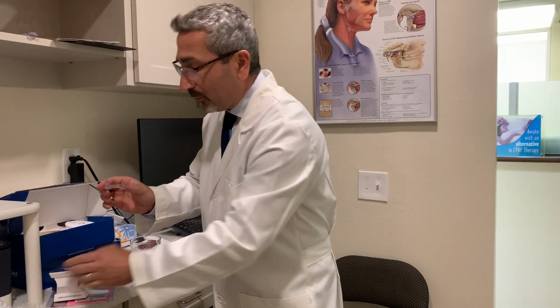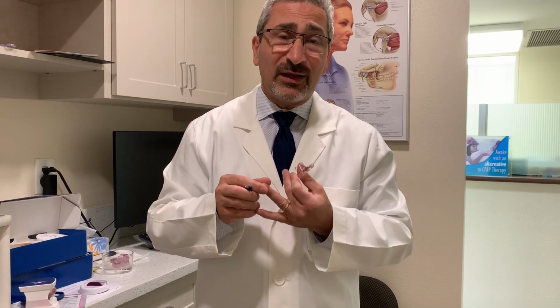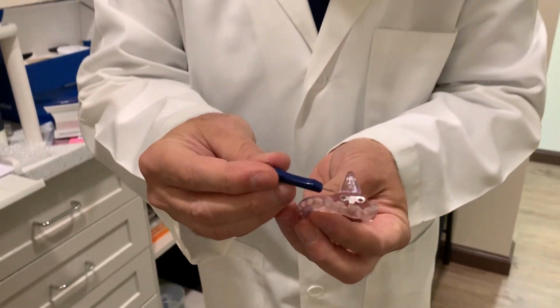we're going to take the lower part. If you're wearing your mouthpiece for the first week or 2 and you're doing great, no more snoring, waking up rested, don't mess with it until you come back and see me at the sleep center. But if you start having some snoring and you're still waking up unrested and tired, we need to do an adjustment.